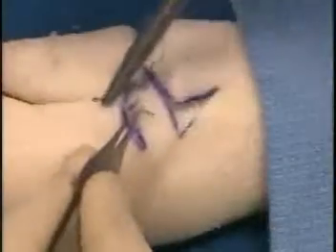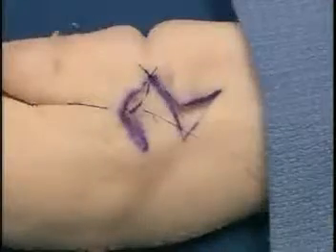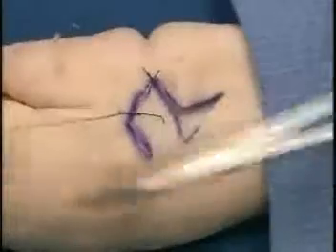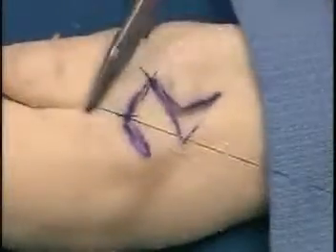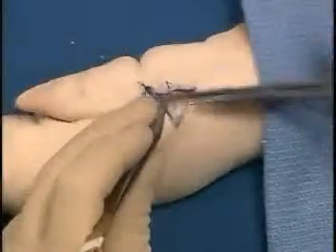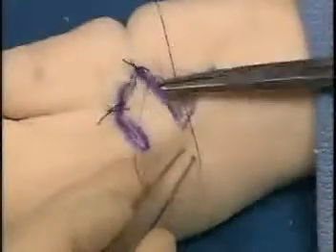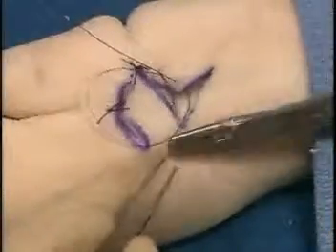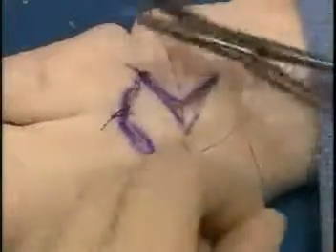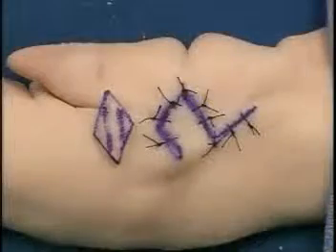Now the second suture is placed again at the apex of the flap, and again it's possible to use a corner stitch if you wish. But in this particular example, we use just a direct interrupted suture technique. And the third apex is now approximated. Deep sutures, if necessary, certainly can be utilized when indicated after adequate hemostasis is obtained. And once all these corner stitches are put into position, then the wound is closed according to the principles of halving.